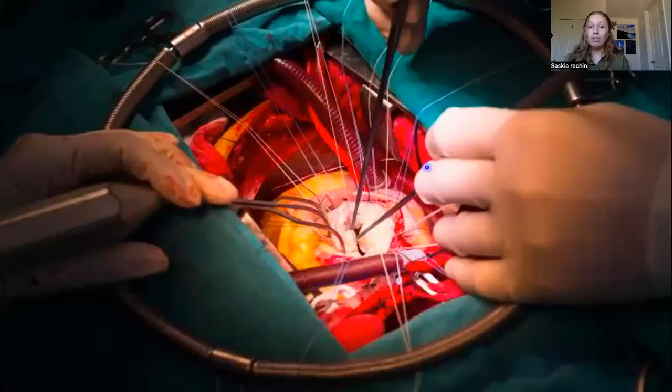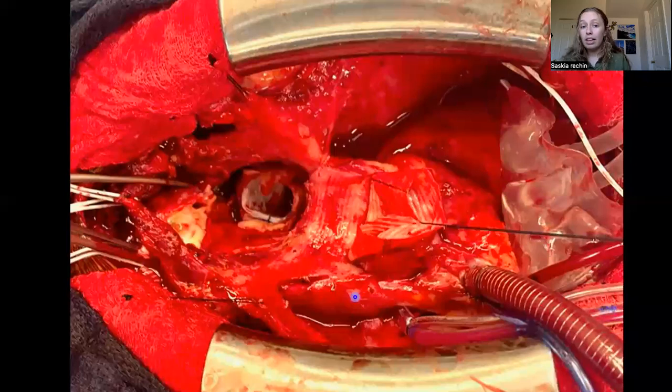All in all, this is going to allow for a lot more extensive surgeries, a lot more ideal surgeries and higher quality. So here you have a mitral valve repair. You can have that bloodless and still environment that's ideal. Here we have what looks like a redo aortic arch or ascending aorta surgery. This is probably going to be longer than 30 minutes, and it's something that's already been exposed to ischemia before, both pre-existing as well as under cross clamp. So you want to have the most optimal protection for that heart for recovery post-op.